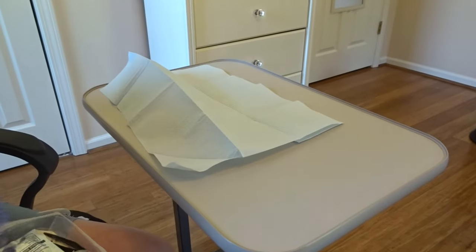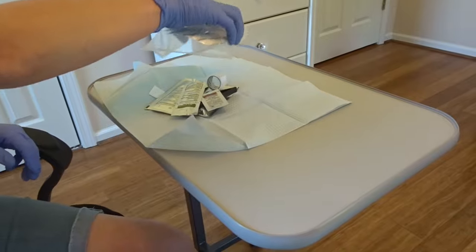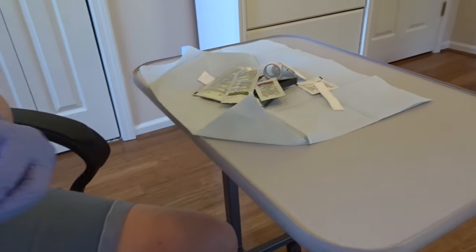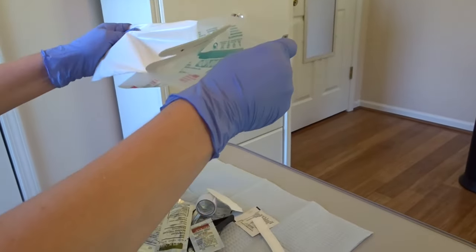Grab the corner and unfold it onto a table, with the section that was touched facing the hard surface. None of the supplies will come in contact with those corners. To not compromise sterility, dump the remaining contents of the dressing kit onto the sterile field.